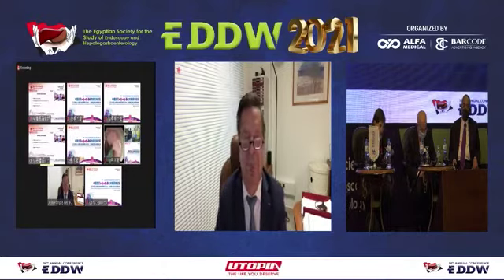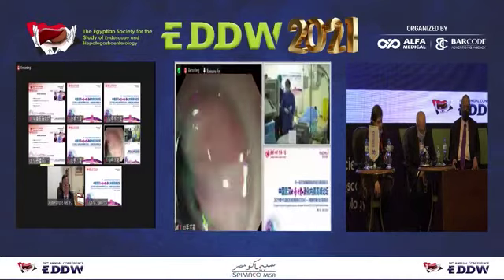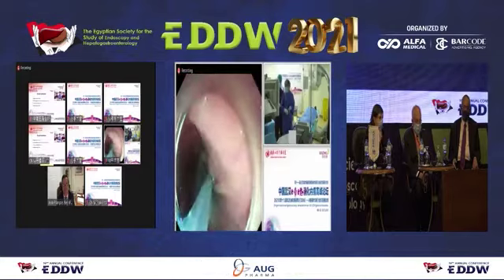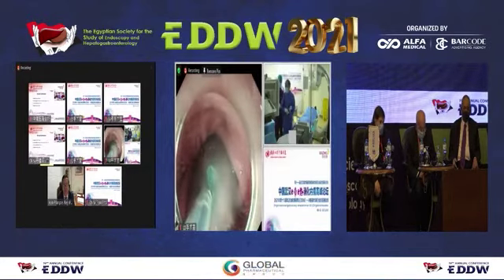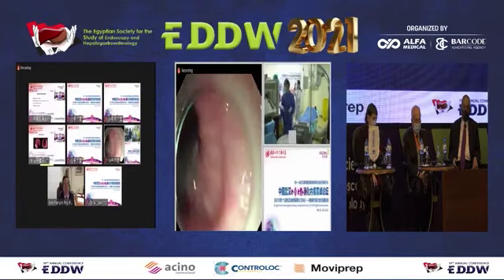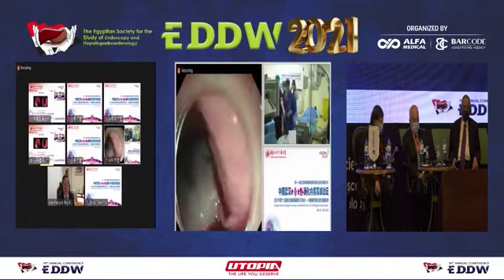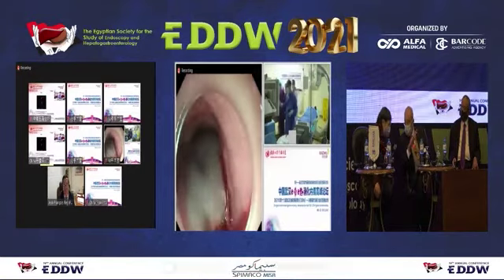Okay, now we will start the second demonstration. Please note the medical history of this patient. Case number 2. This is a 60-year-old female patient. Chief complaint: intermittent nausea and vomiting for 1 year. Previous medical history, nothing significant. Diagnosis is cardiac achalasia.